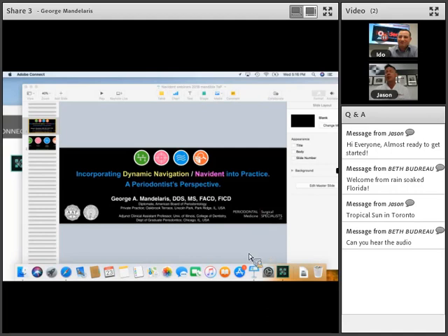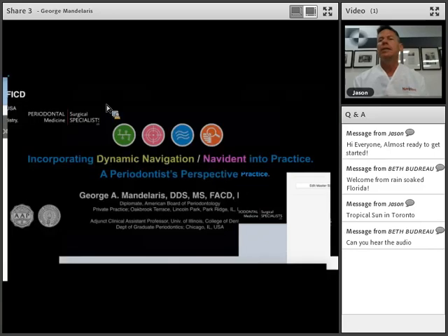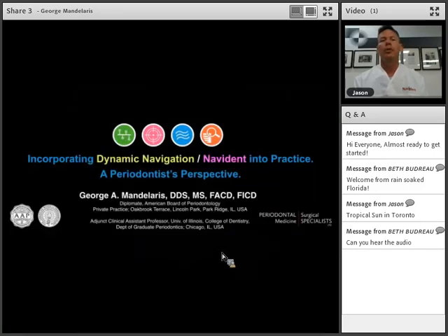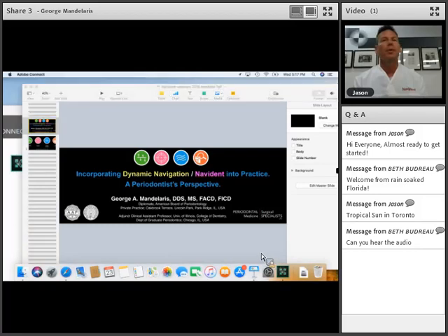And now to share some of his experiences with mandibular use of the TaP, I would like to introduce George Mandelaris. George attended the University of Michigan from undergraduate through dental school in 1989. He completed a 3-year graduate residency program in periodontology at the University of Louisville School of Dentistry, where he obtained also a master's in science degree in oral biology. George, please share your cases and impression of TaP in the mandible with us.